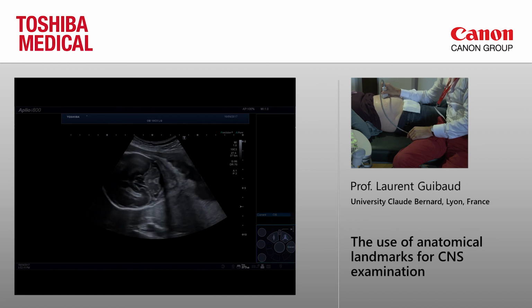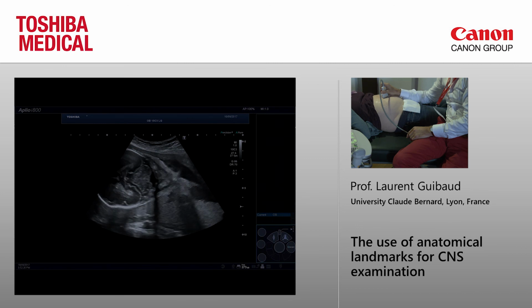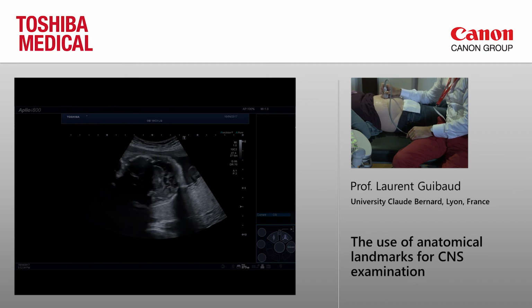You see the foliation clearly here, and I don't know why, but when I have to measure the TCD late in the pregnancy, I found that it was easier to see on the coronal view than on axial view. And you see here clearly the foliation. You see the foliation also here. The foliation is transverse.